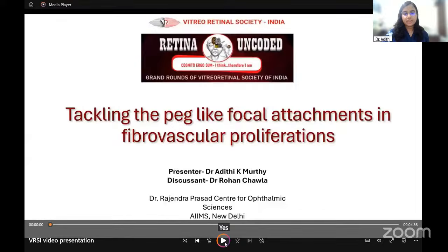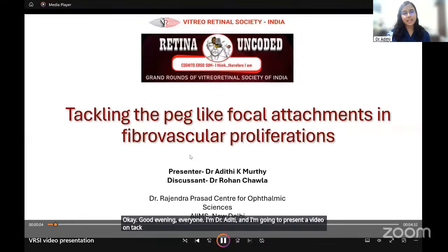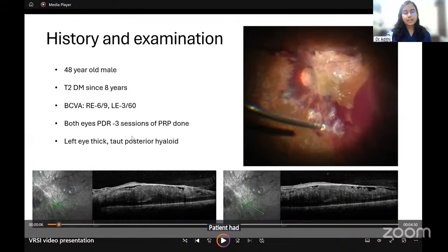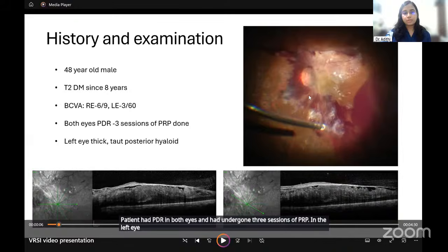Good evening, everyone. I'm Dr. Aditi, and I'm going to present a video on tackling the peg-like focal attachments in fibrovascular proliferations. Our patient is a 48-year-old male, a known case of type 2 diabetes since 8 years. The best-corrected visual acuity in the right eye is 6/9 and in the left eye is 3/60. The patient had PDR in both eyes and had undergone 3 sessions of PRP. In the left eye, the patient had a thick taut posterior hyaloid causing distortion of the macula. Hence, he was planned for left eye pars plana vitrectomy.